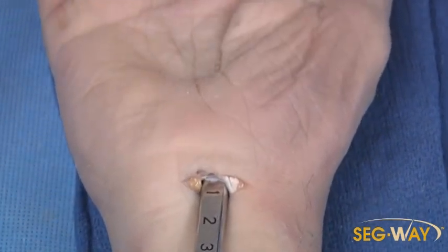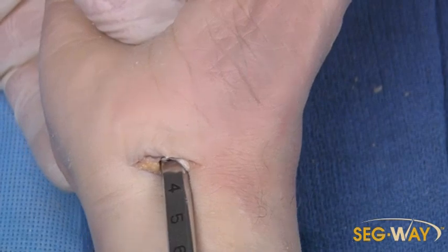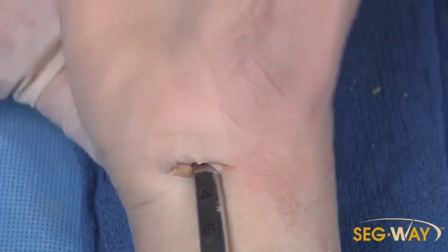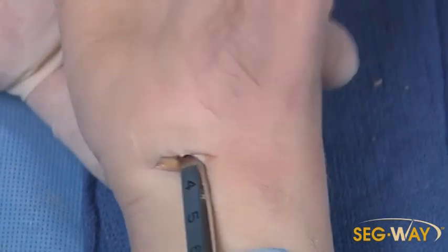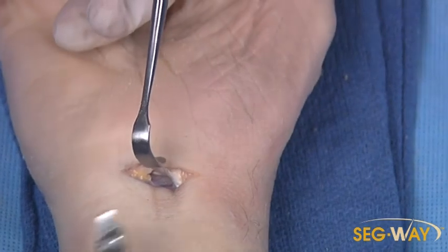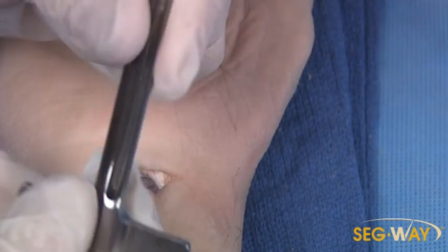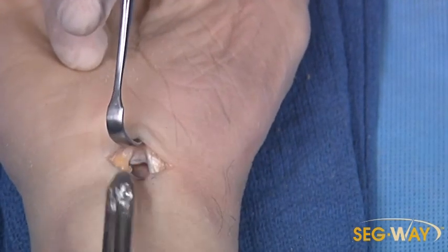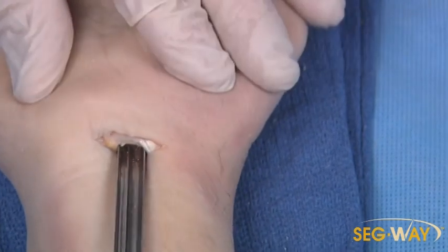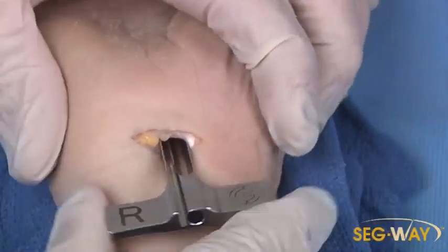With the larger size dilator, aim straight down and just let it go where it wants to go. You can see the position is aiming between the web space, usually between the long and ring fingers. Now we're ready for the guide — this is a right hand, so we're using the right guide, which is marked right and left. Push it all the way in to at least four centimeters, then use a roll towel under the hand to increase the working surface.